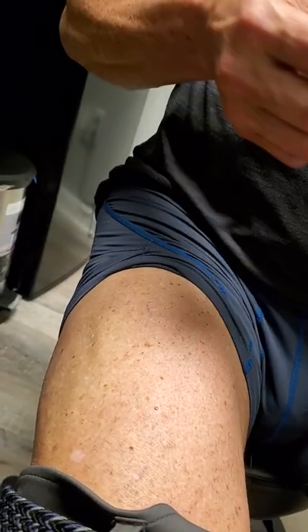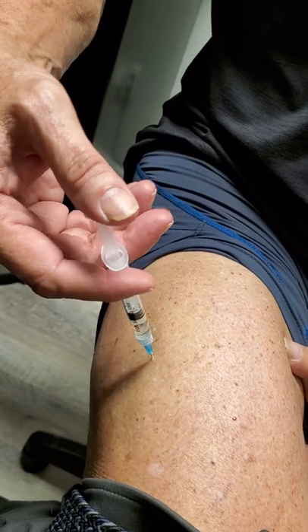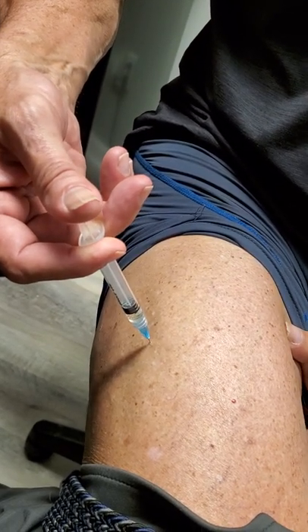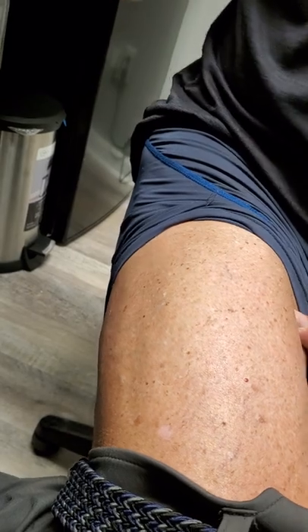So I'm sitting down. I wipe it with alcohol. I take my tip off. I take my needle, just like it's a dart, all the way in. Push it — and you'll notice it's kind of a hard push because it is oil-based. All the way to the bottom. And I pull it out. And that's it.